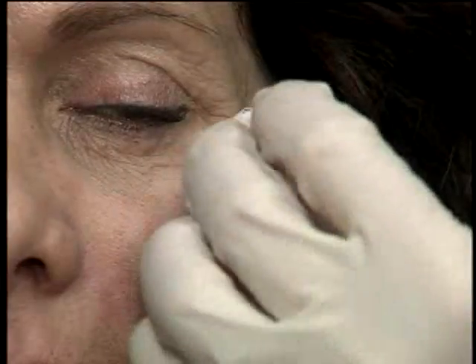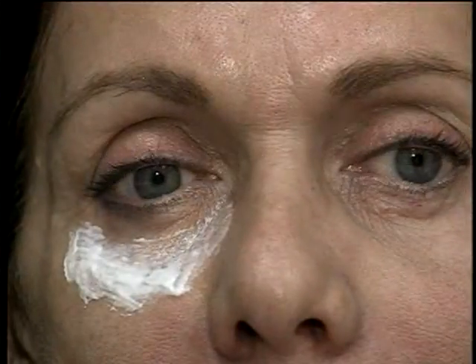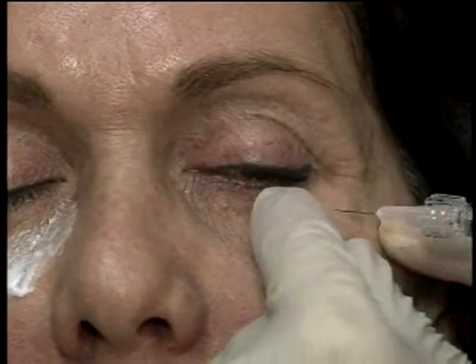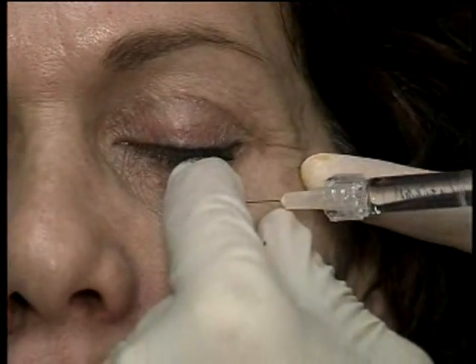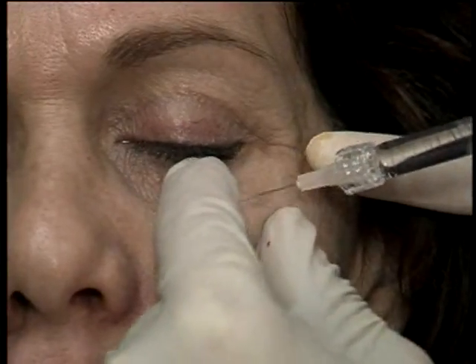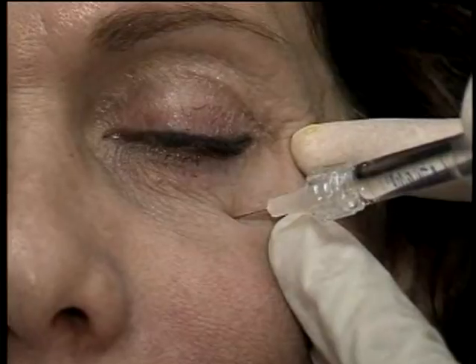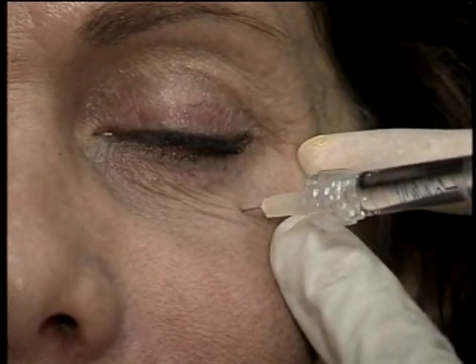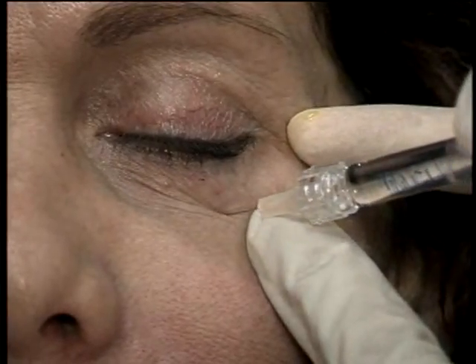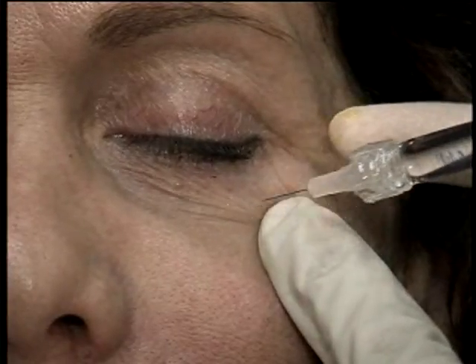Now this area is often anesthetized with a little bit of topical anesthetic, and that's all that's required. As you can see how it's placed there, you let it sit there for 15 to 20 minutes, and that's all that's usually required in order to give anesthesia in this area. So I have my fingers protecting the globe, and I go down to the orbital rim. I feel the bone, and I deposit just a little bit. Depositing just a little bit onto the bone. So I'm at the bony rim, depositing just a little bit. And make sure I feel the bone, and deposit just a little bit.